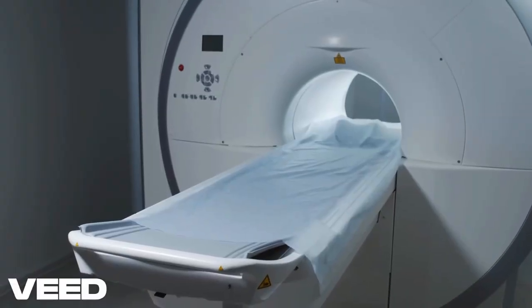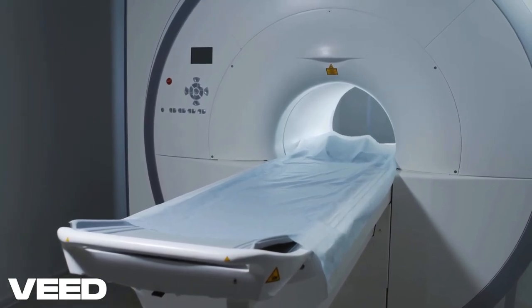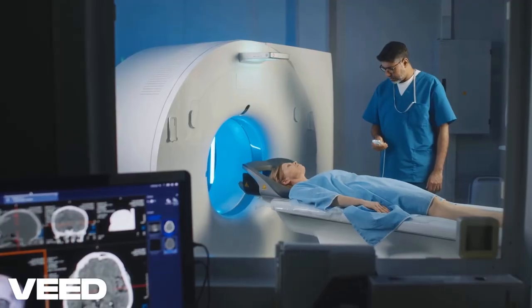And PET-MRI scanners are now emerging. These offer excellent soft tissue detail with less radiation than PET-CT.